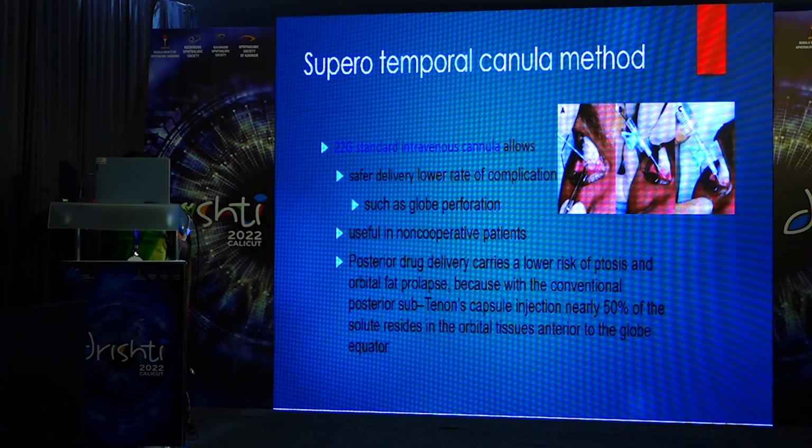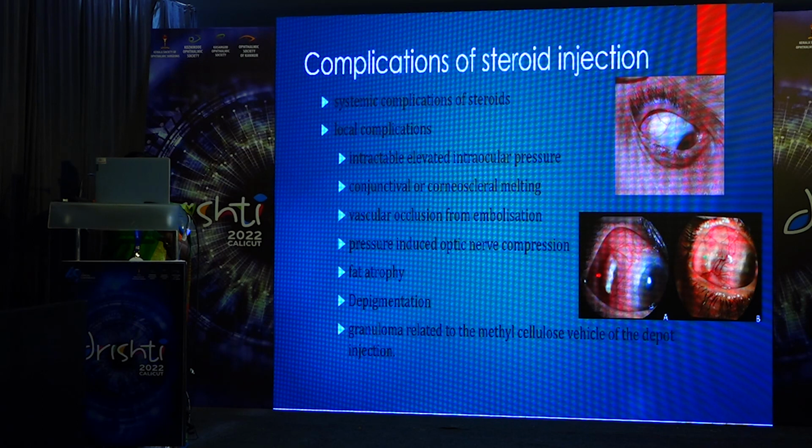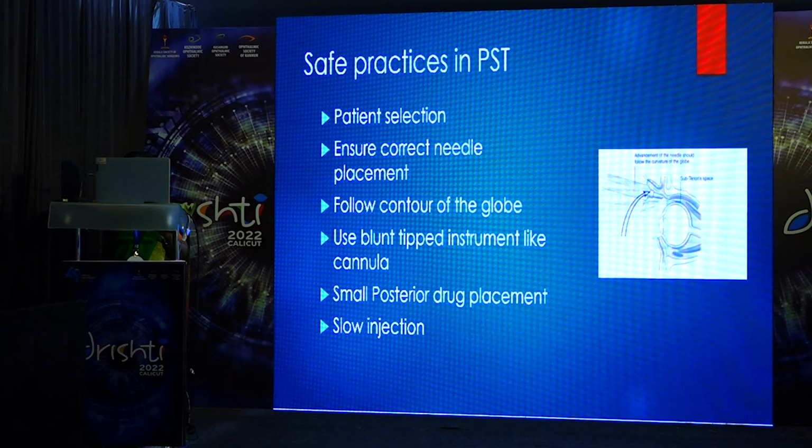So the alternative technique to avoid globe perforation is a supratemporal cannula method, where you can use a 22 gauge standard intravenous cannula instead of your needle. All complications of steroid injection can happen. This is not per se due to the technique.